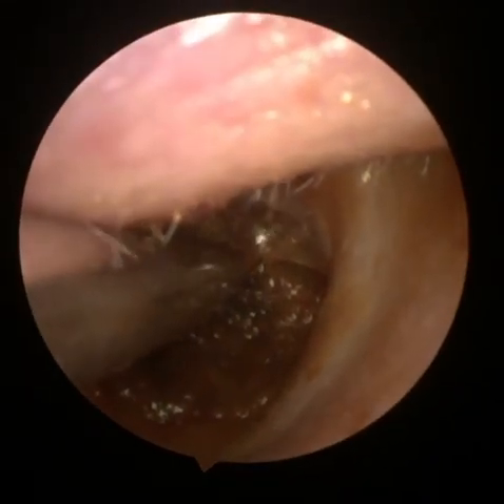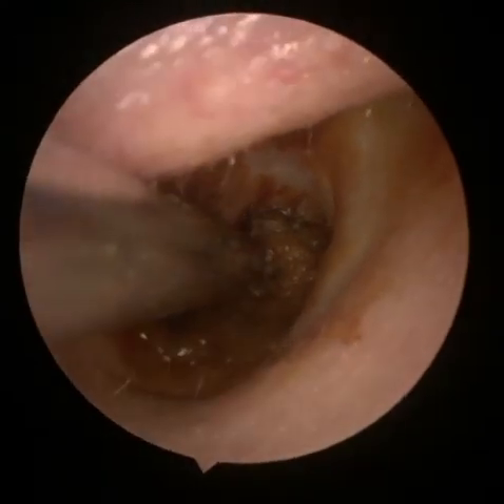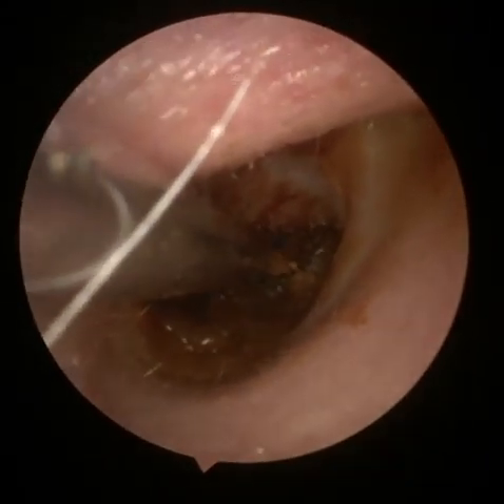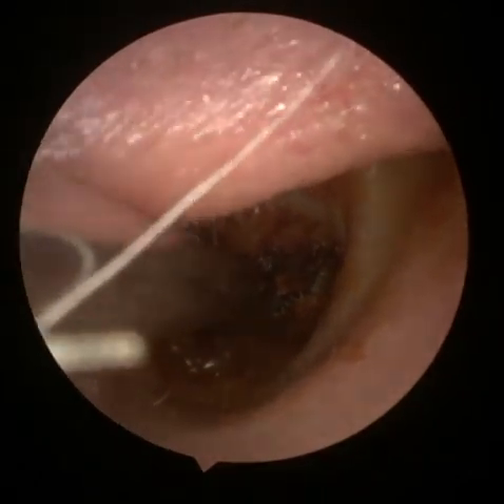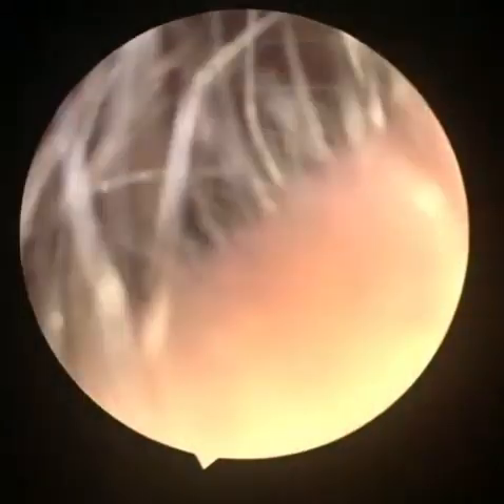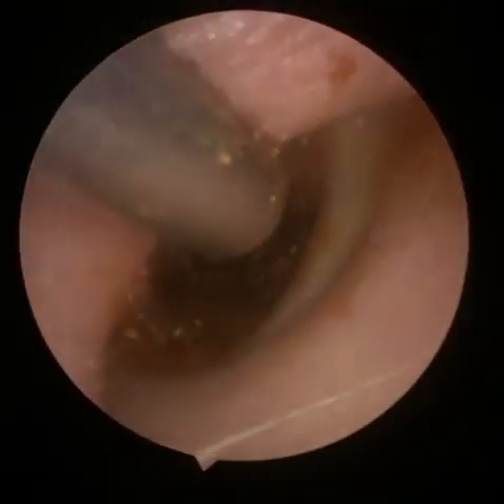With this type of wax you often find that you have to take your time and be patient — you certainly can't rush it. You'll find that you have to go in quite a few times; it's not the type of wax that's going to come out in just one go. The endoscope often gets a little bit dirty, so re-clean and go back in.